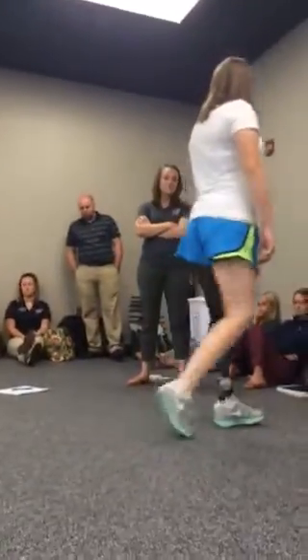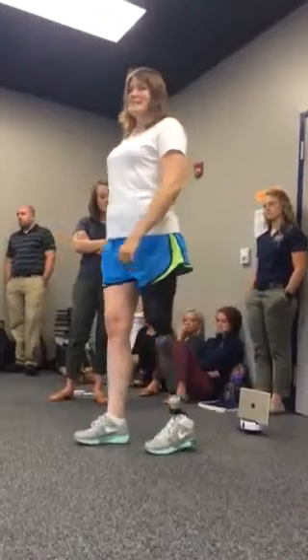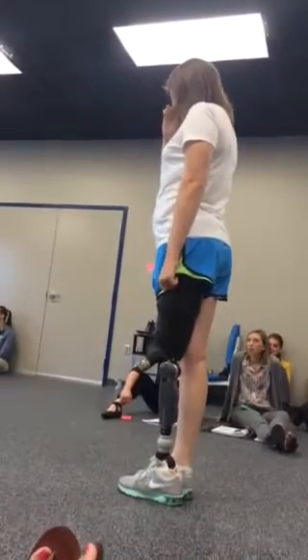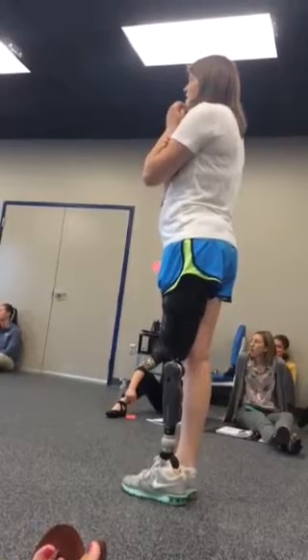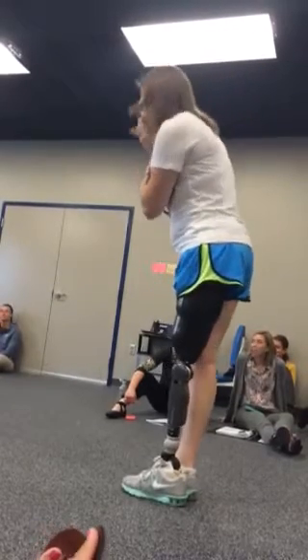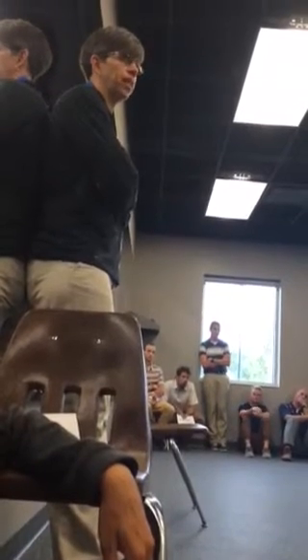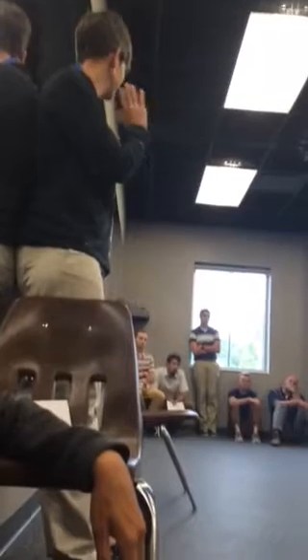All right. So what do you guys think? How's she doing on step width? When she's walking, it kind of seems like the faster she goes, the more it seems to go that way. When I think she starts thinking about it, having a bunch of people looking at her walking. It adapts in what way now? That's immediately. Her prosthetic one does? Yeah. Anyone else see that? I'm not questioning you. I'm in this plane. Yeah.